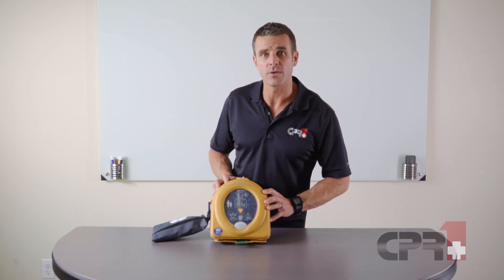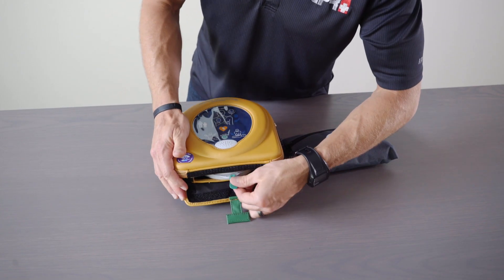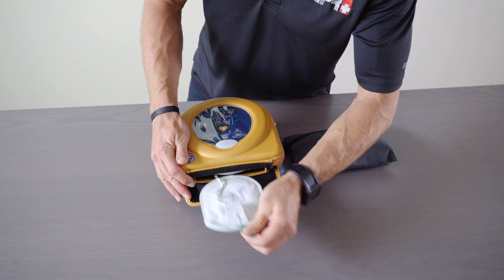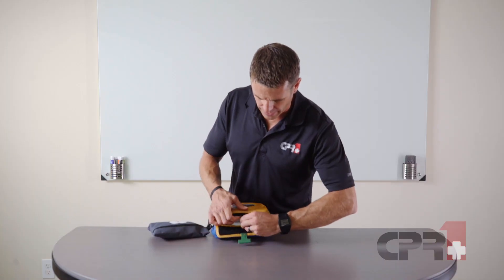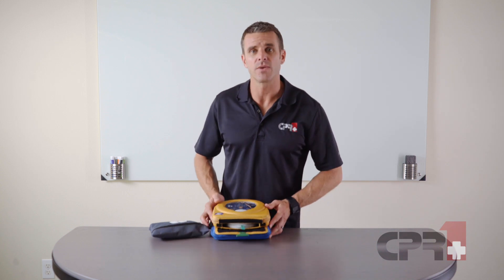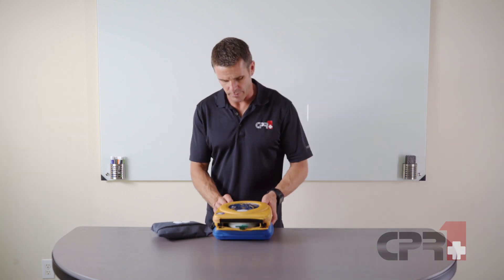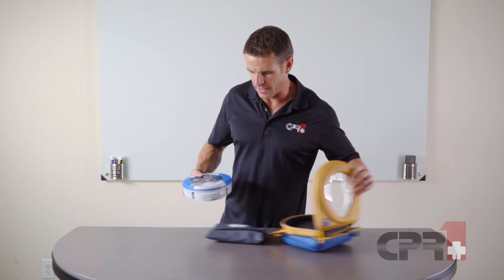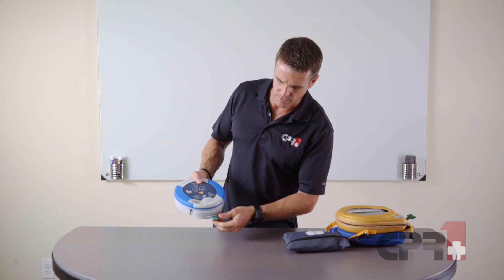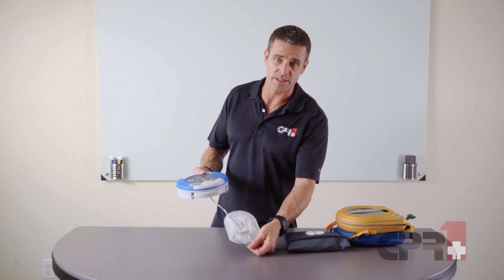In order to remove the pads, we're going to pull this green tab on the case, and you can then pull the green tab here on the AED to pull the pads out. You can do everything you need in the emergency event right with the AED in the case, but just for purposes of demonstration, I'll pull this out and show you how we pull that pads cartridge out, exposing the pads.